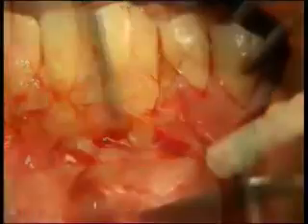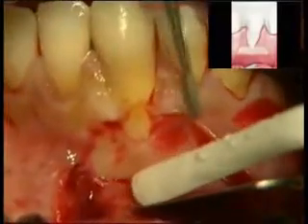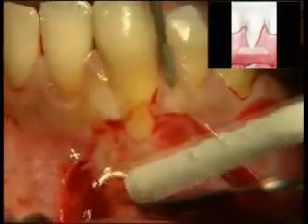Subsequently, using a 40-micron diamond burr, the disepithelialisation process is completed.